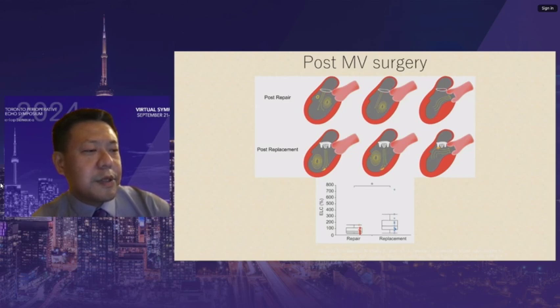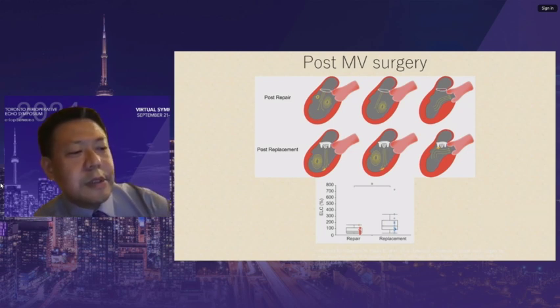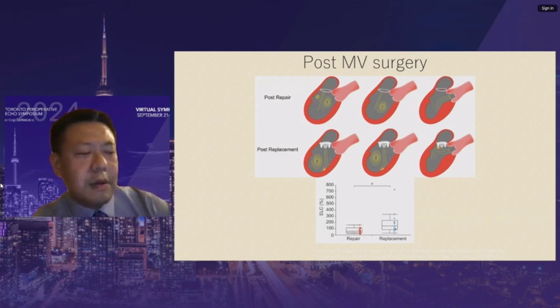The reason for this condition is quite natural. The native mitral valve leads the inflow to the apex, but the artificial valve leads the inflow in the perpendicular direction of the mitral annulus. Therefore, the inflow collides with the anterior wall and the ejection flow collides with the stent post, and energy loss increases. Next slide.